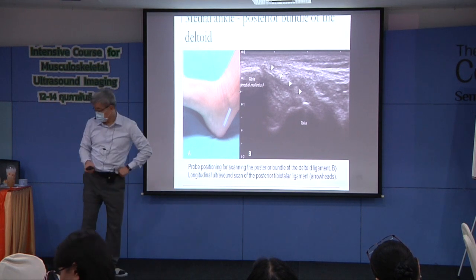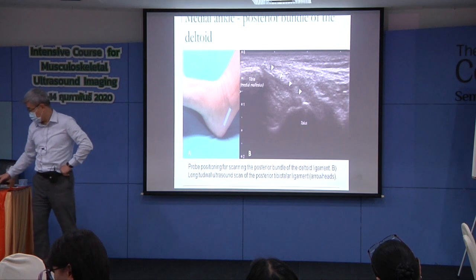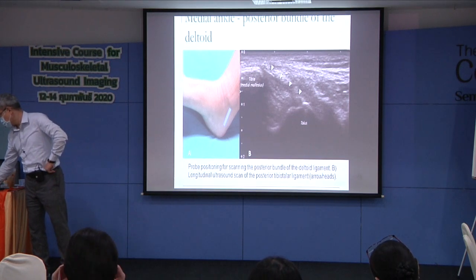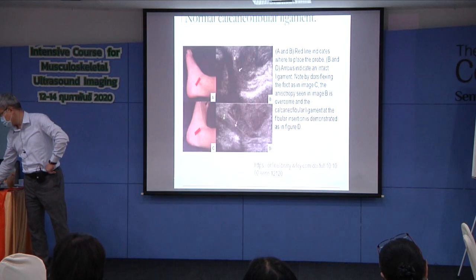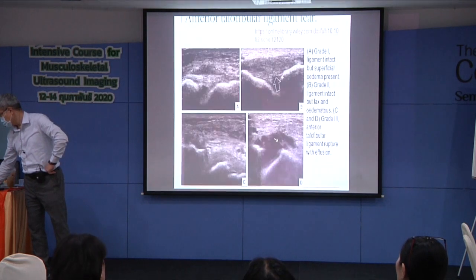Okay, that's the structure we are going to practice this afternoon. I will start from the tarsal tunnel.